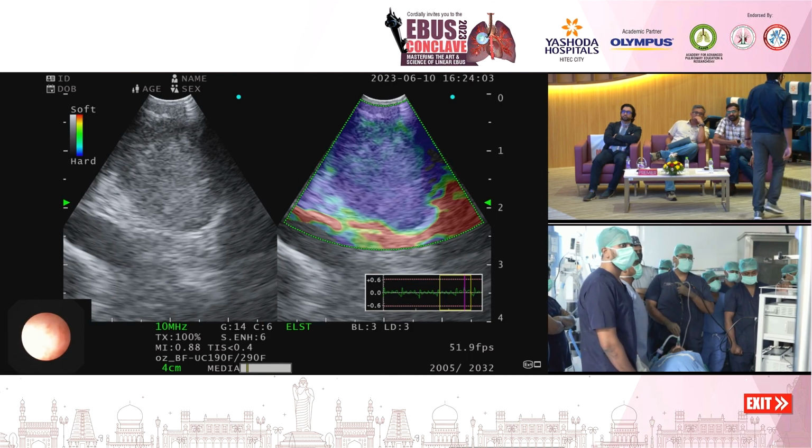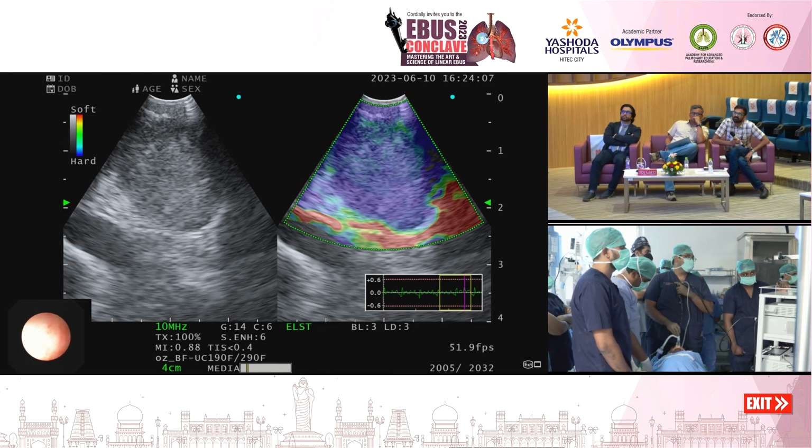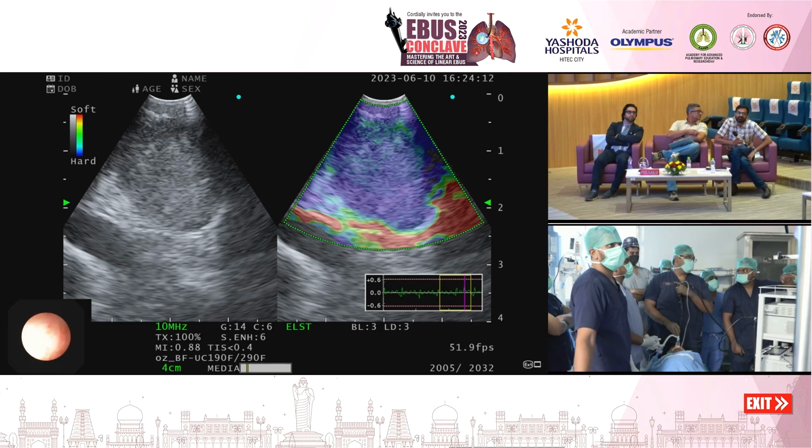So this case was anyway high probability for malignancy. You had an infiltration of the right ventricle also. It's a huge, predominantly blue node. So there is a high chance of it being malignant.